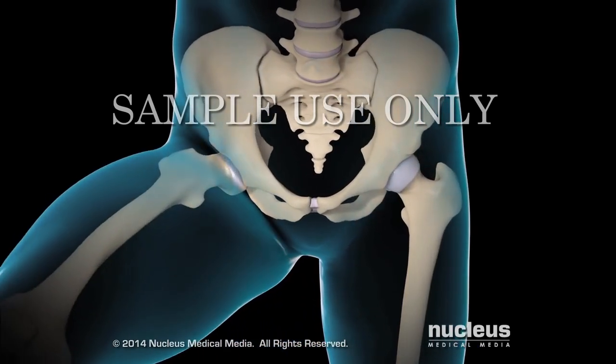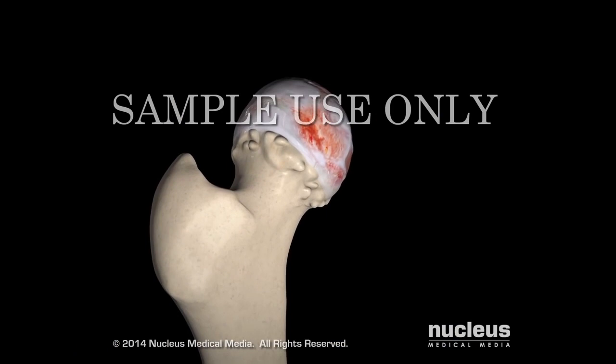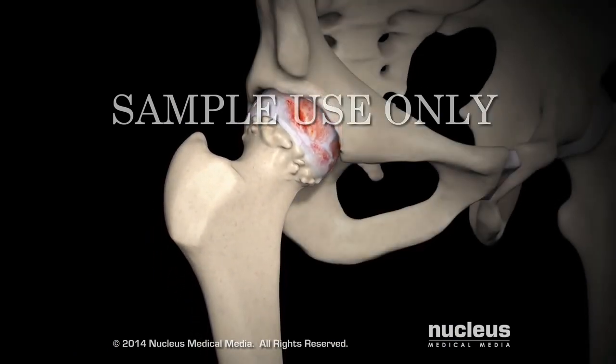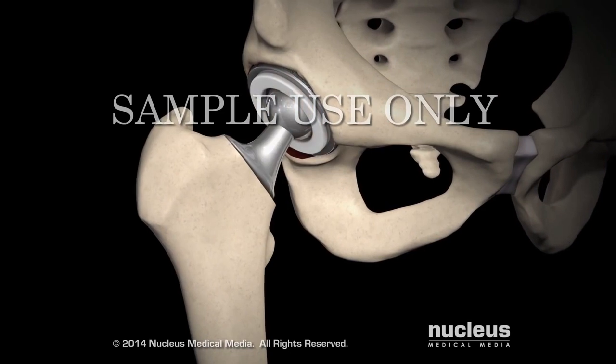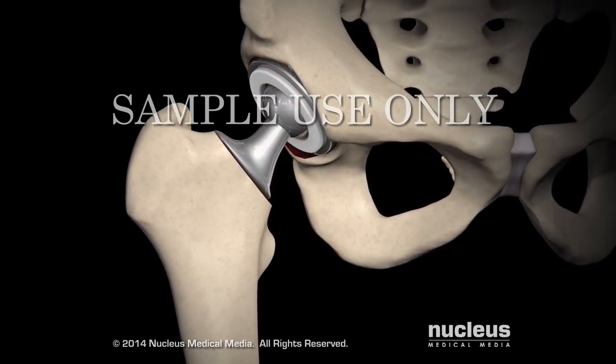A total hip replacement is usually done when severe damage from arthritis or injury has made it difficult to perform daily activities without severe pain or restricted range of motion. During the procedure, the femoral head and acetabulum are replaced with artificial components called prostheses.